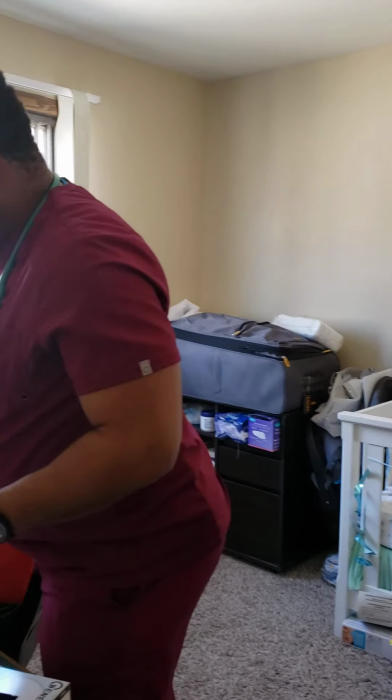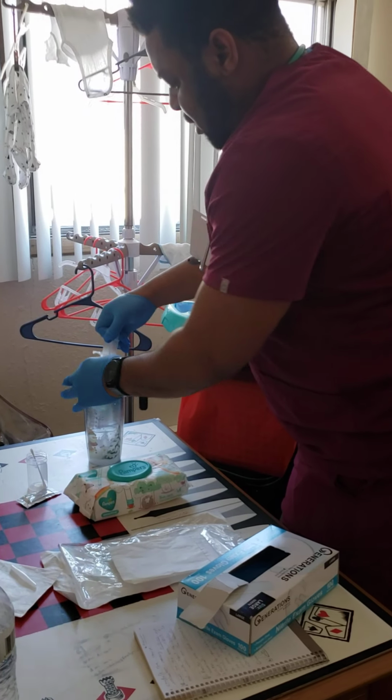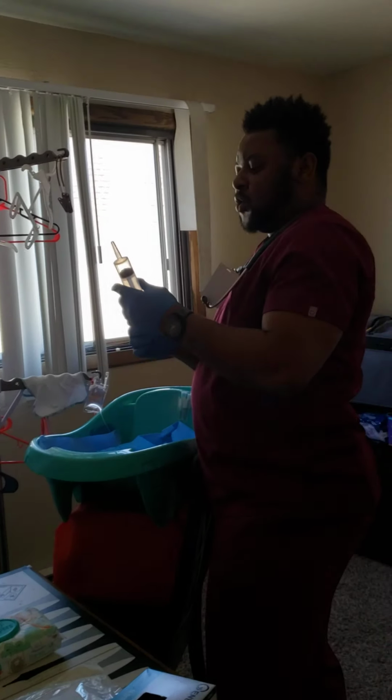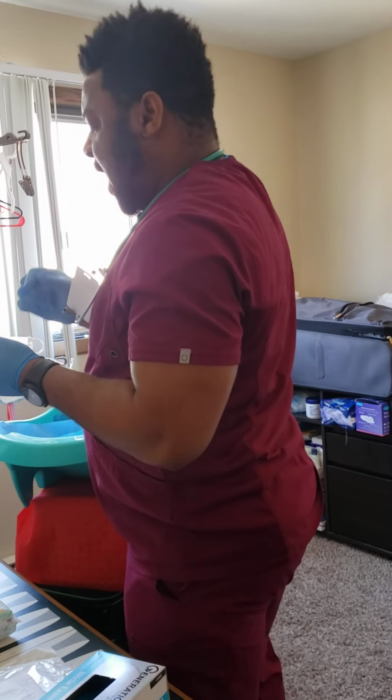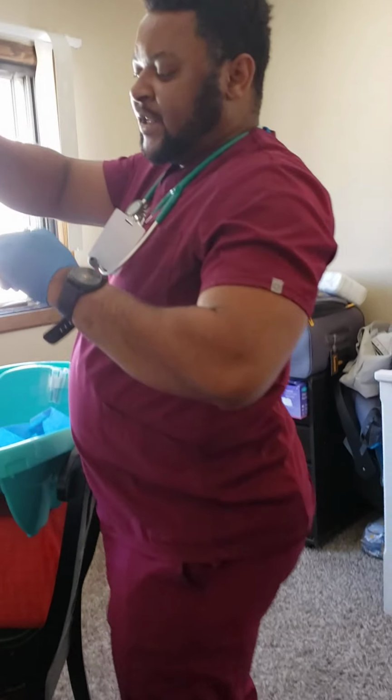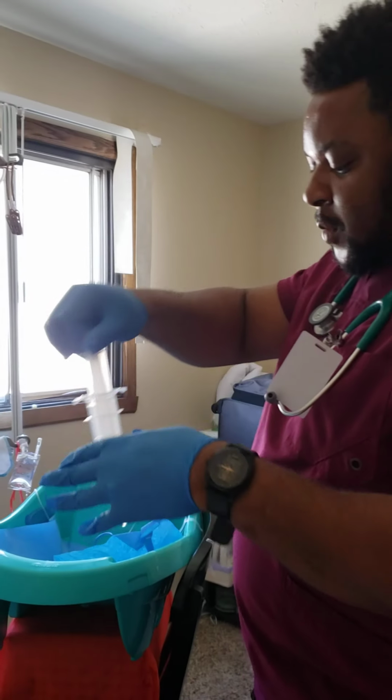Right, then I'll draw up 20 milliliters of water in my syringe, and also 20 milliliters of air, making it 40 milliliters of water and air, making sure my water is at the bottom while the 20 milliliters of air is at the top. Put my syringe right there.